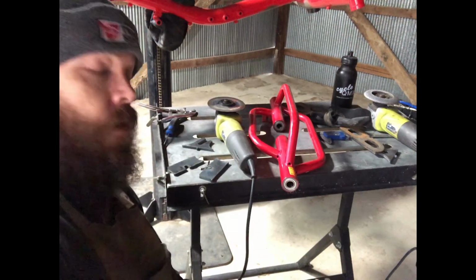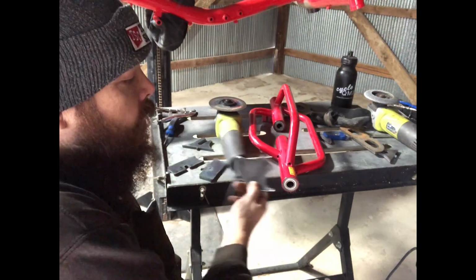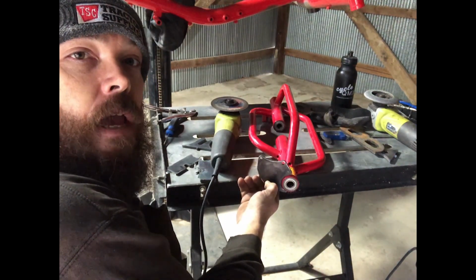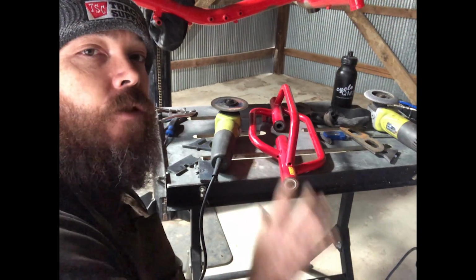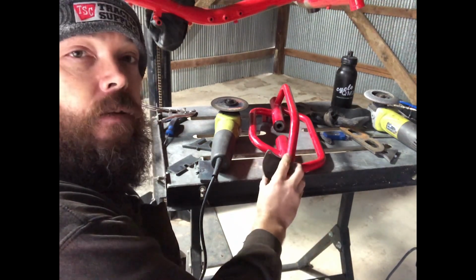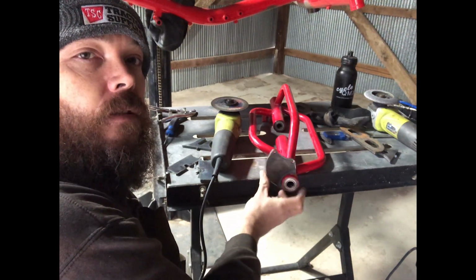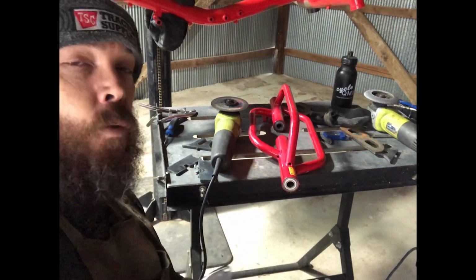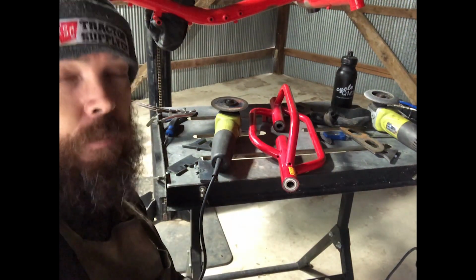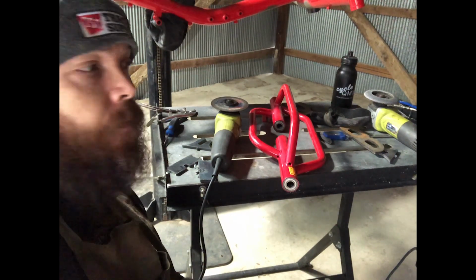Now, if you're going to do the posi differential, typically these would go out on the end here, and you would want to have your disc brake mounted directly to your wheel, and then your disc brakes out here on the end, like such. And you'll put one on this side and then one on the other side, and that way you have dual rear disc brakes for that independent differential.